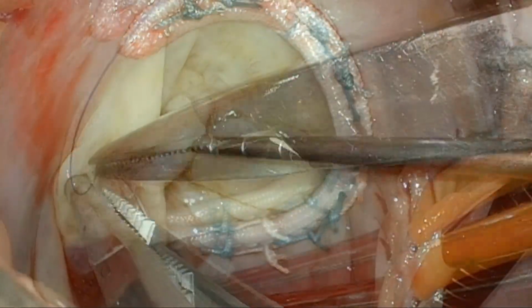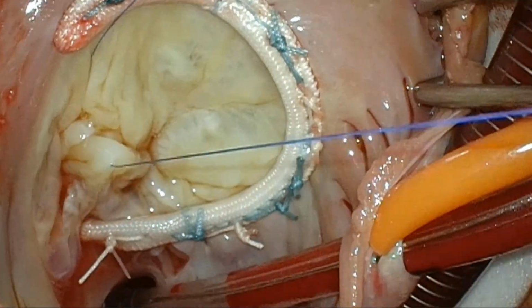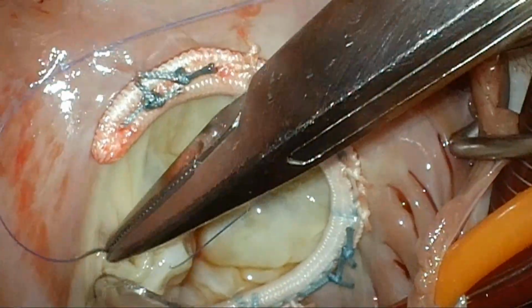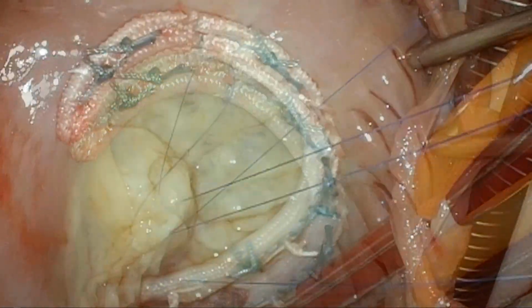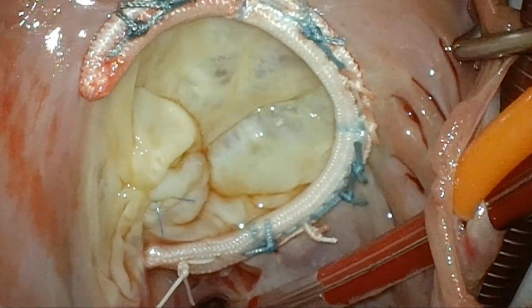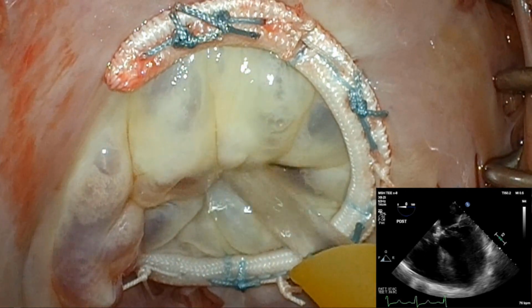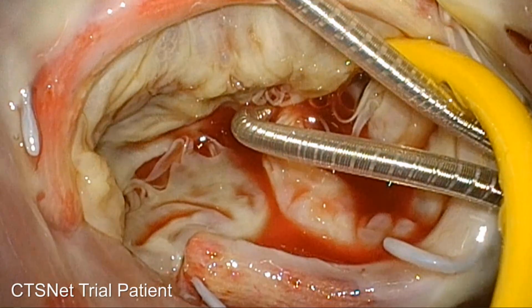Like here, you can see some leak between the septal and the anterior leaflet. So we use adjunctive tools like commissuroplasty sutures between the anterior and the septal leaflet. That's the most common site where we put the annuloplasty suture. And I think that's what they do also in clipping the tricuspid valve most of the time. That's not going to create any dysfunction or tricuspid stenosis. Those valves are massive. And you see the final echo result, a very good tricuspid repair.